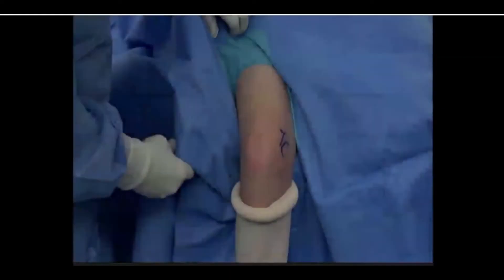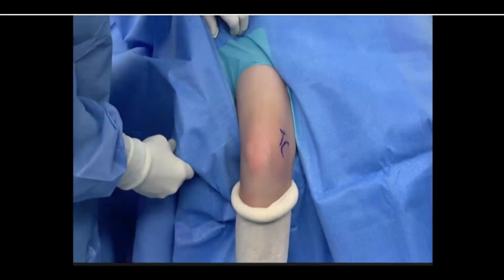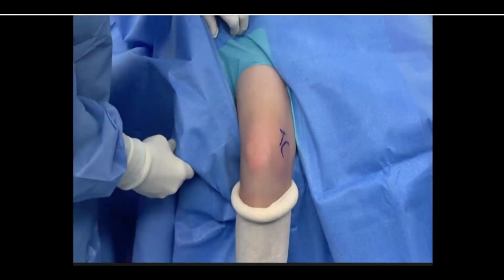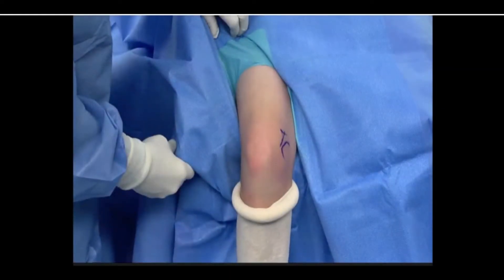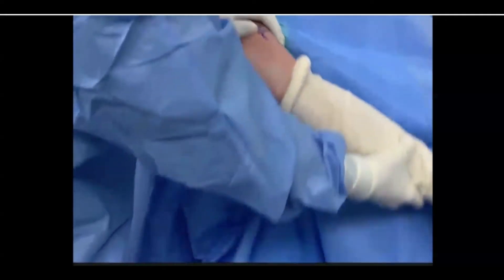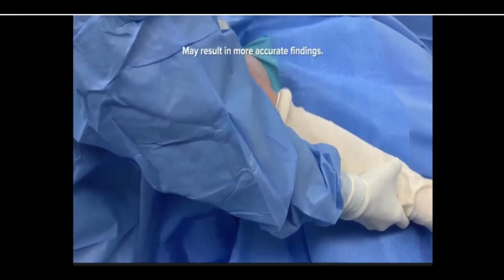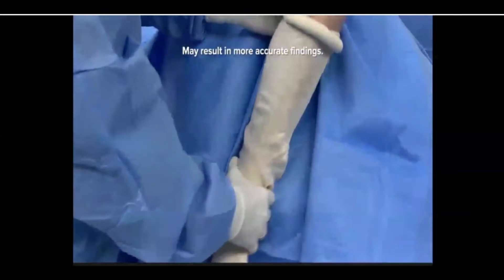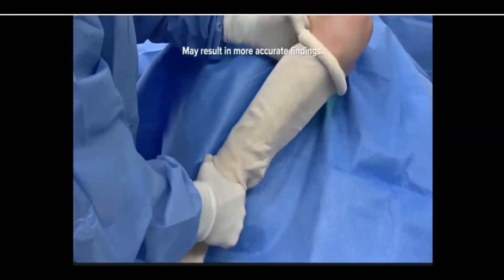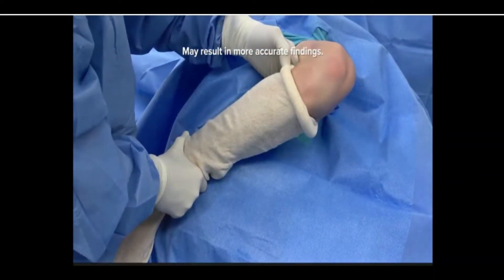With the patient positioned and under sedation, it is a good practice to complete an examination under anesthesia. This may result in more accurate findings without voluntary or involuntary guarding by the patient.